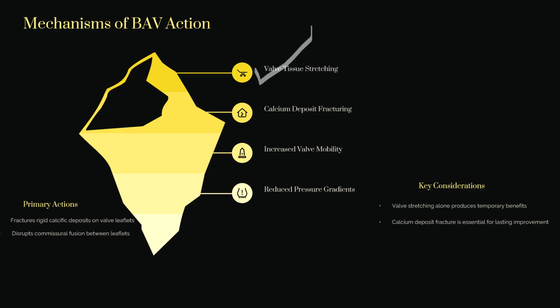Valve tissue stretching, next calcium deposition is fractured, then increased valve mobility, and lastly reduced pressure gradients.